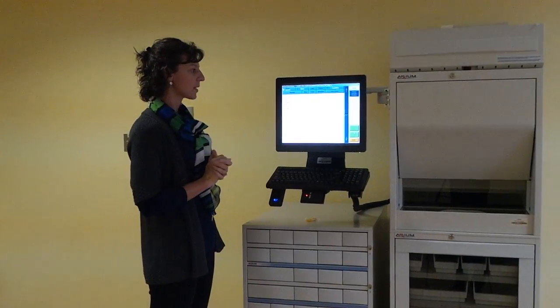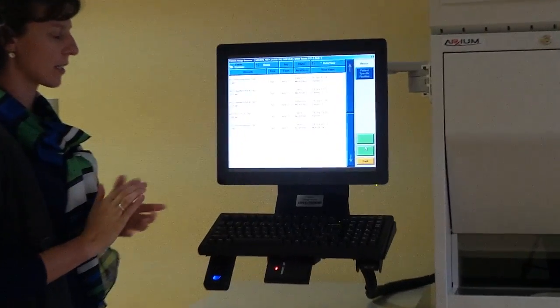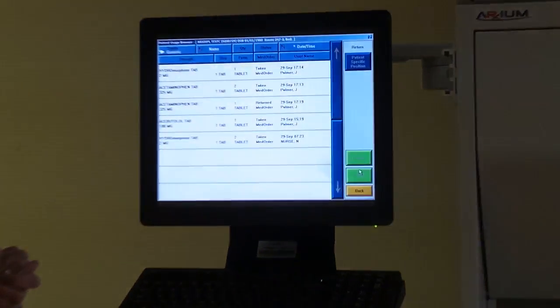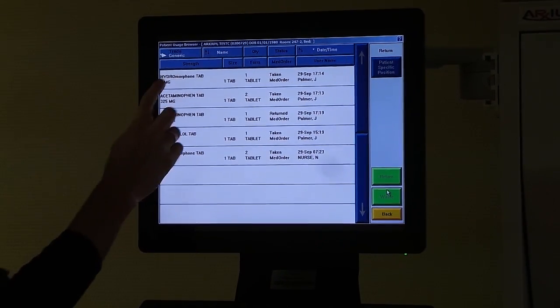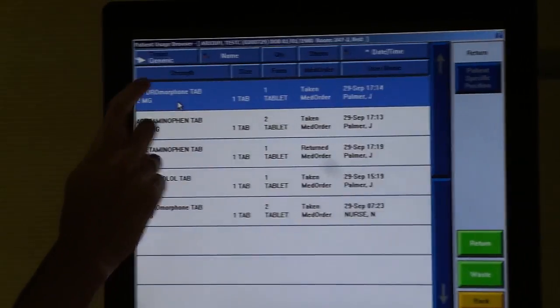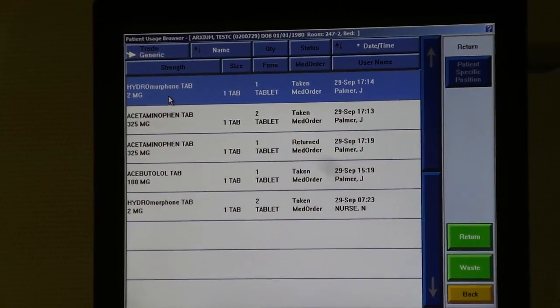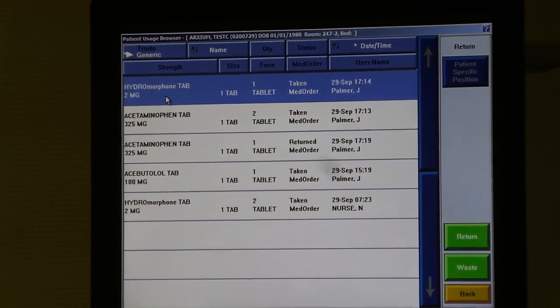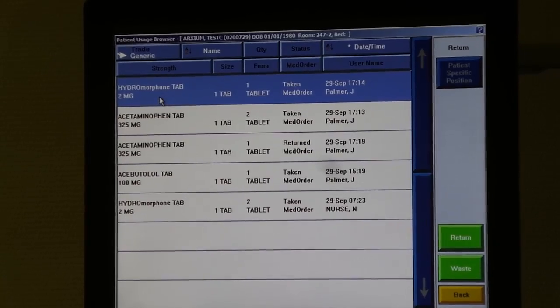To waste a medication, it's very similar in process. In this case we're going to waste this hydromorphone tablet. Simply select the medication by touching the screen and it will then be highlighted in blue.